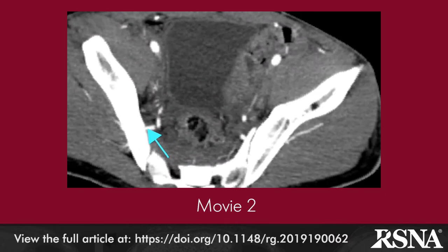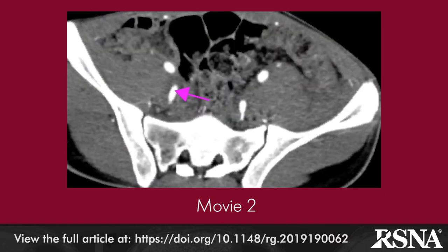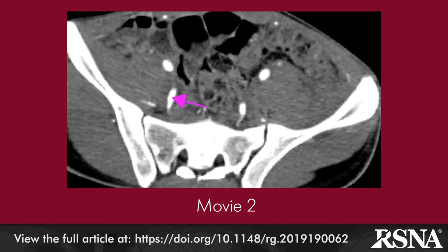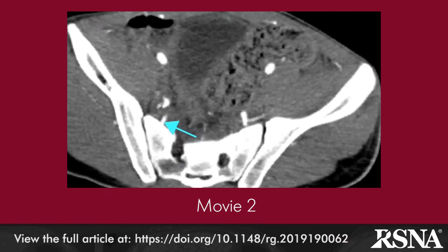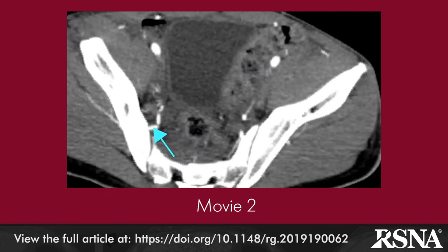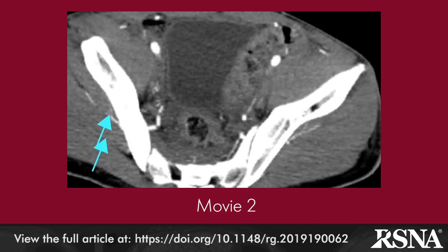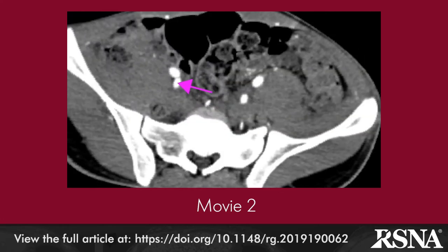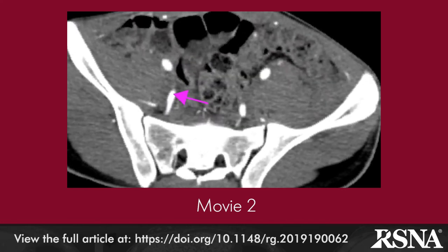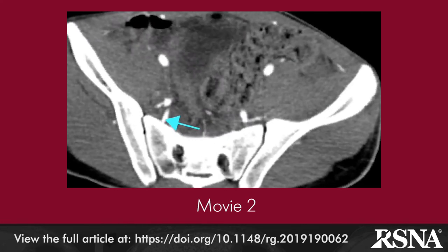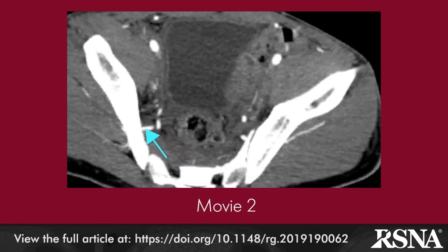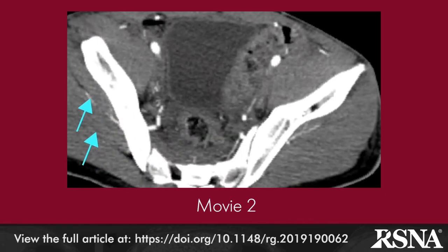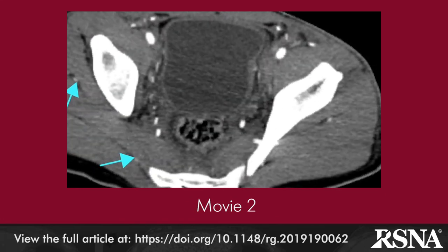An axial maximum intensity projection CT of the pelvis in the craniocaudal direction in a 31-year-old man shows a colored arrow that follows the course of an artery arising from the posterior division, lying anterior-inferior to the sacroiliac joint, curling under the greater sciatic foramen, and exiting the pelvis above the piriformis muscle, following a superior concave arch-like trajectory.